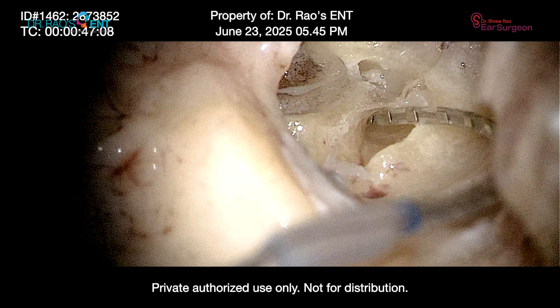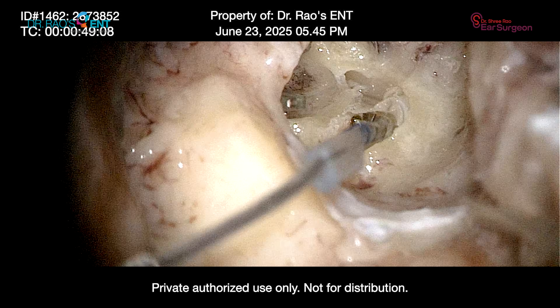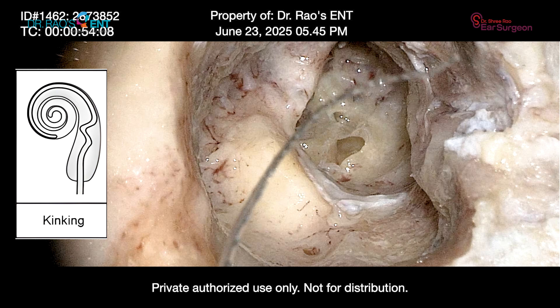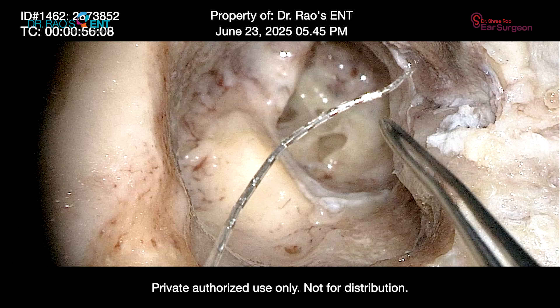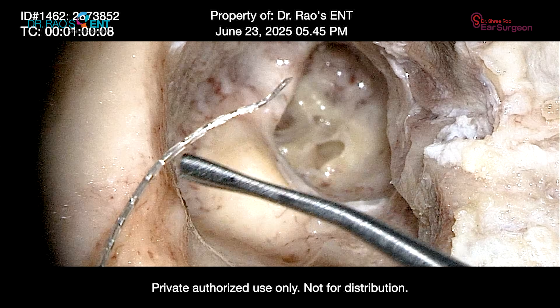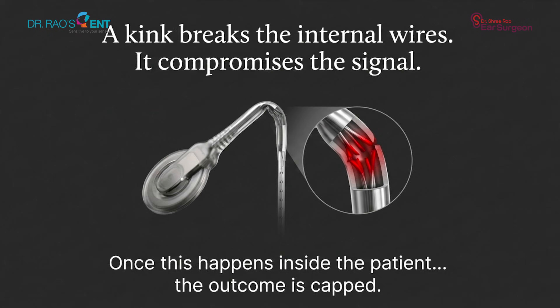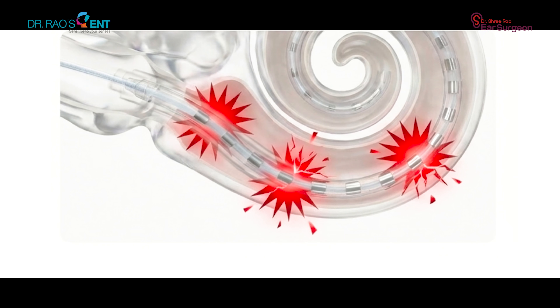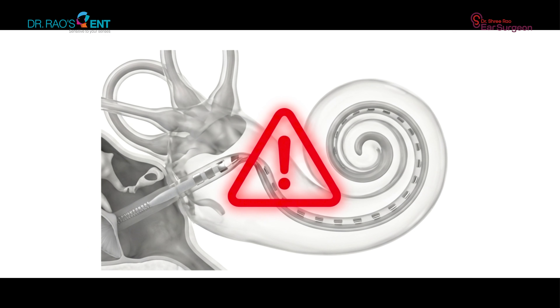If the angle is wrong or the force is too high, the electrode buckles — it kinks. This kink breaks the internal wires and compromises the signal. Once this happens inside a patient, the outcome is gone due to physical damage. They'll see high impedance and dead channels, and no amount of software tuning can fix a hardware installation failure.